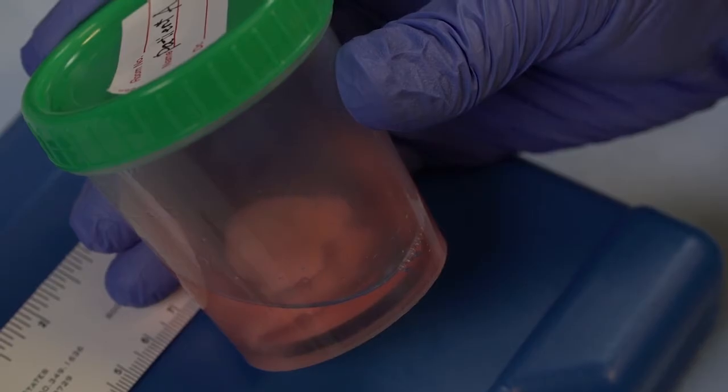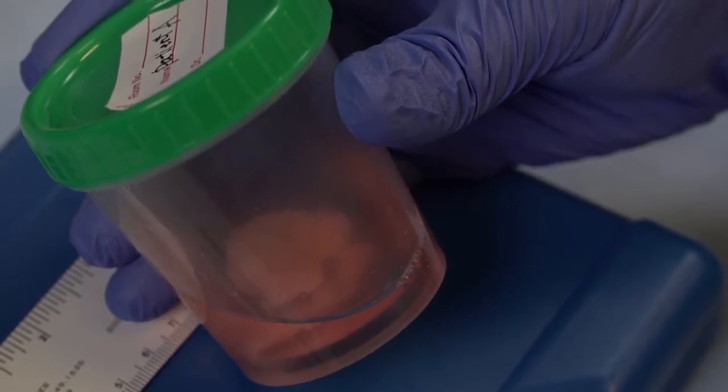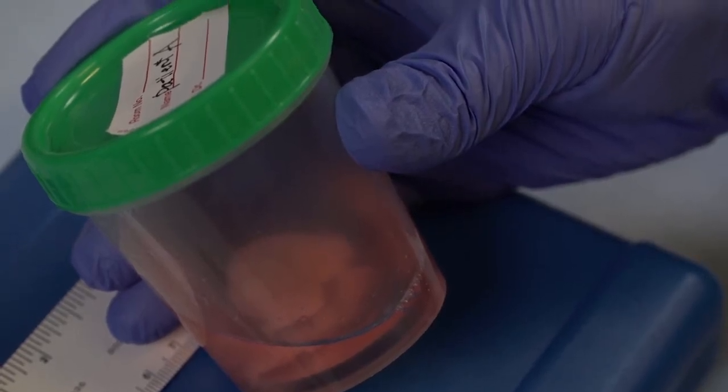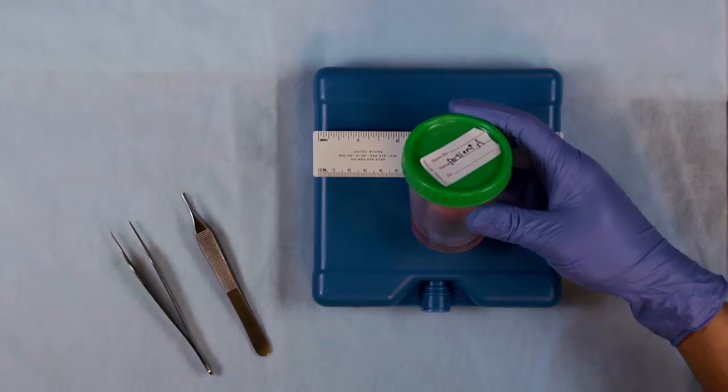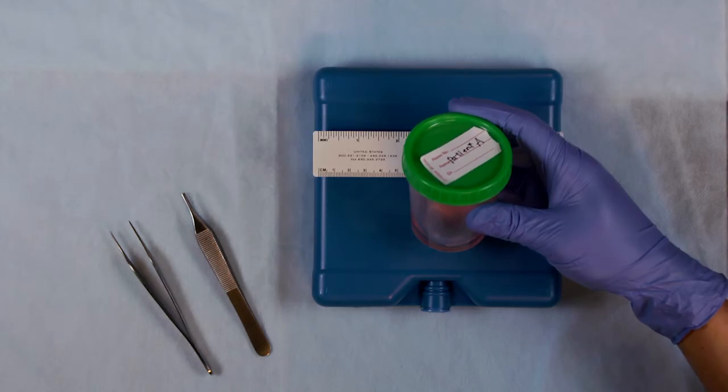And be dissected in cold media on an ice surface. If you are doing ovarian tissue cryopreservation and in vitro maturation, ovaries must be transported to the lab in room temperature media within 30 minutes.